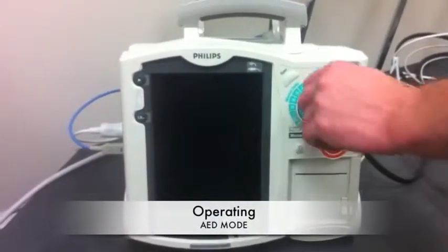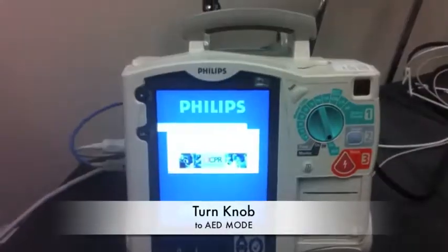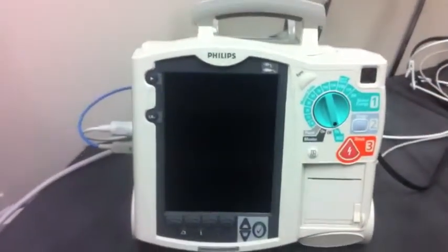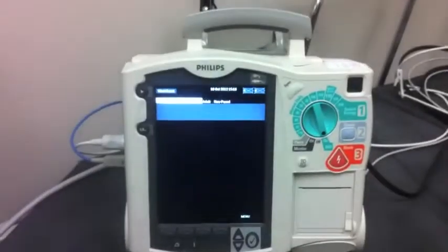Operated as an AED, we flip the knob to the left and the AED function comes on. This patient is in ventricular fibrillation. There is a boot-up period, so it may even be helpful to start this before you hook the pads up to the patient.